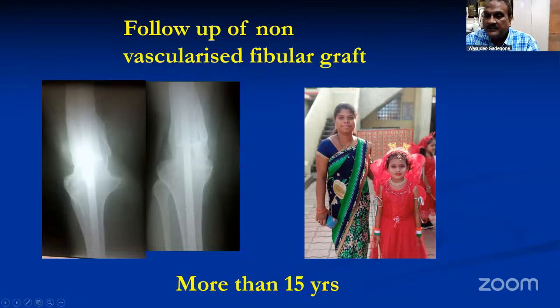When I did the operation, she was not married. And you can see the daughter of that lady. You can see the hypertrophy of the bone and incorporation of the two fibulae, taking the shape of the parent bone.